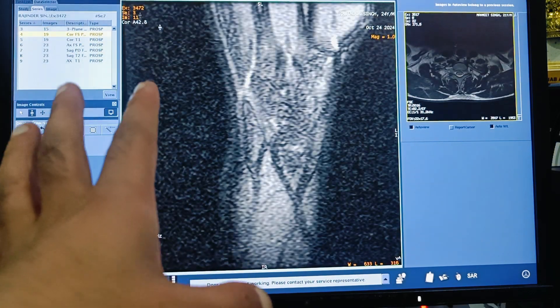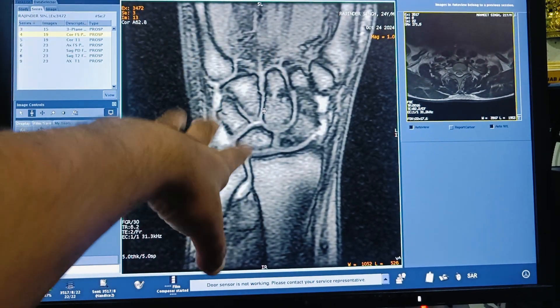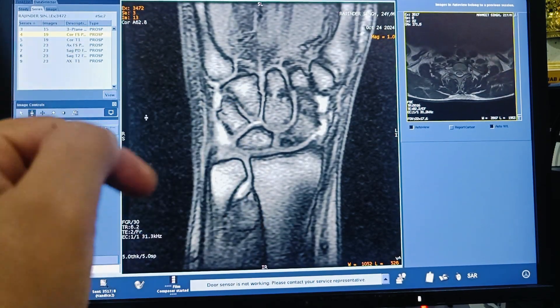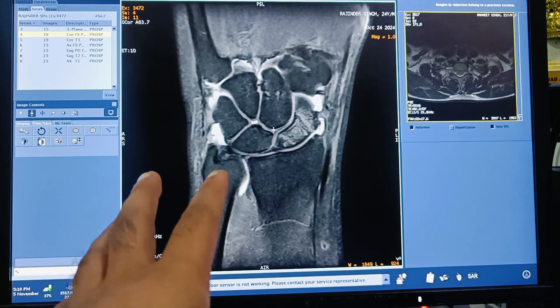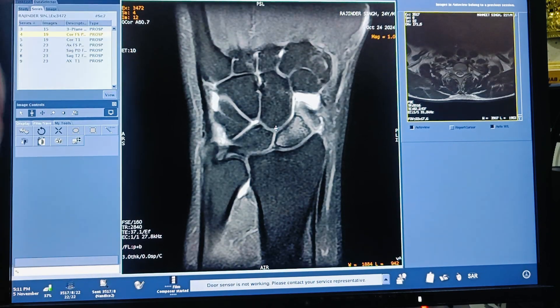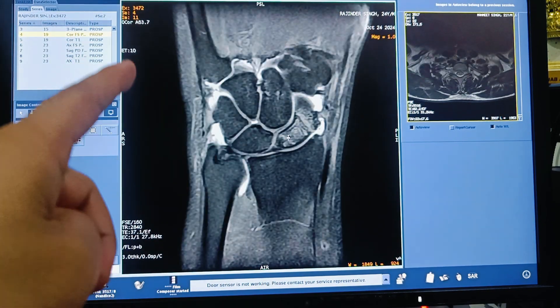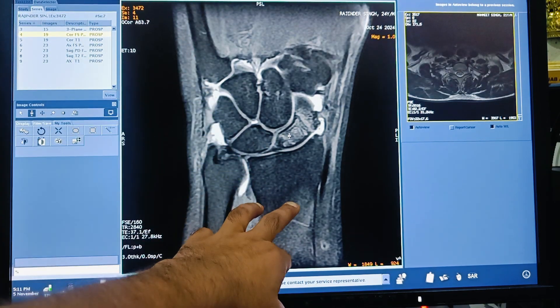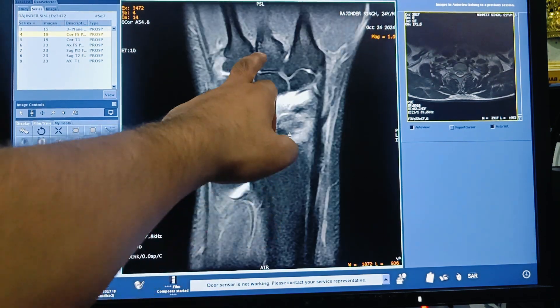I will open the sequences one by one. The first is the localizer, and then the coronal PD fat suppression sequence, which is the most important sequence whenever you perform any musculoskeletal MRI. The PD fat sat sequence completely suppresses the signal of fat, making fat hypointense.